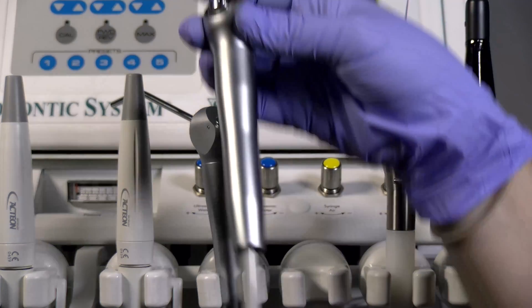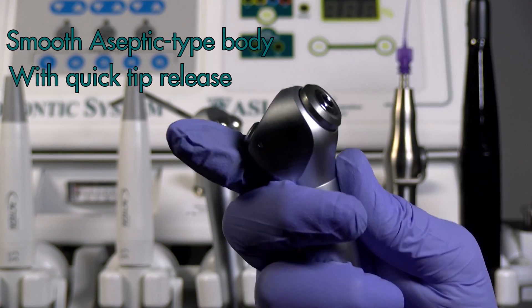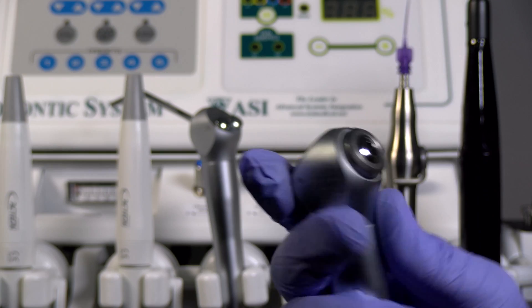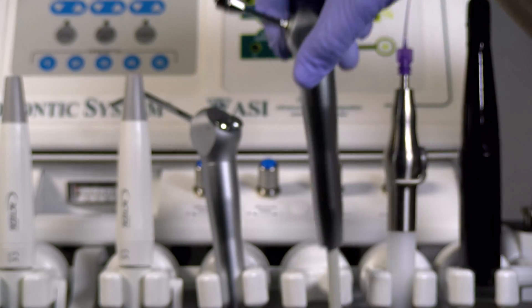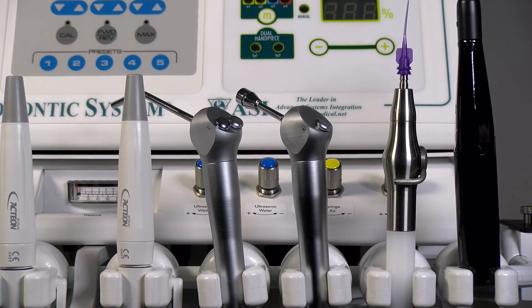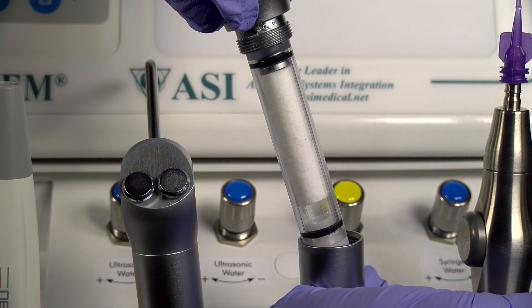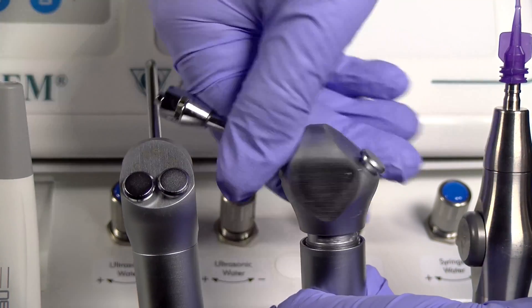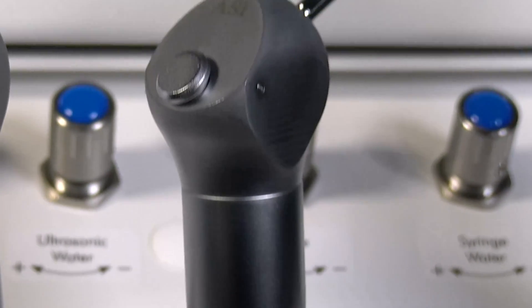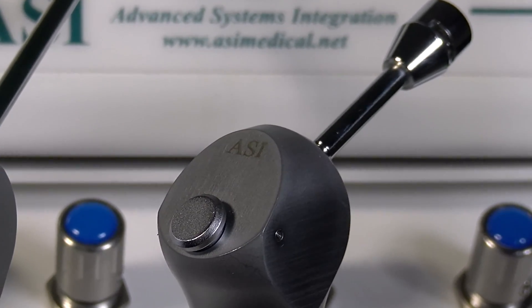ASI's air water syringe is a smooth aseptic type body with quick tip release and can be easily converted for common brands of disposable tips. The advanced dental system features a high flow air only bonding syringe with internal drying filter to aid in moisture removal from the air stream. The advanced endodontic systems feature a Stropco endosyringe with ultra low air pressure for use with endotype irrigating needles.